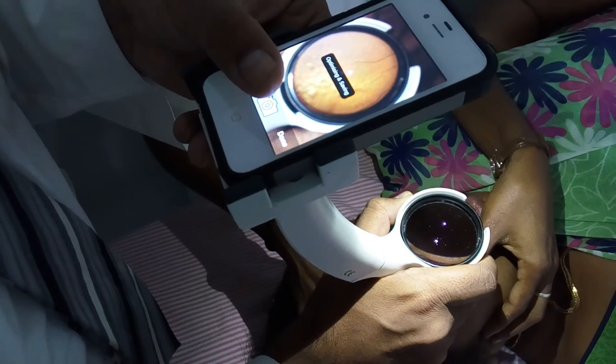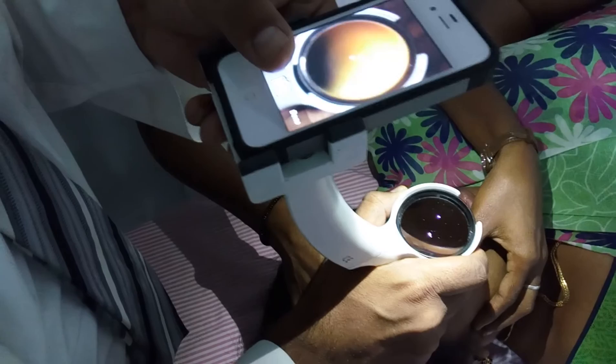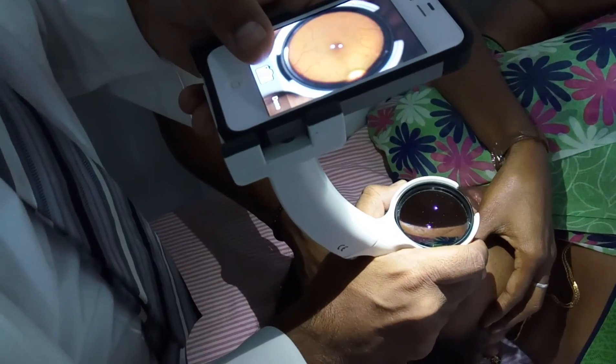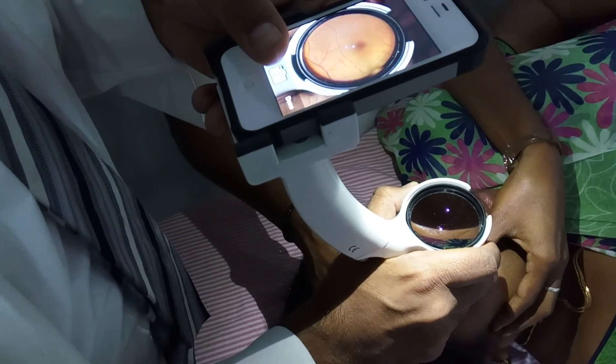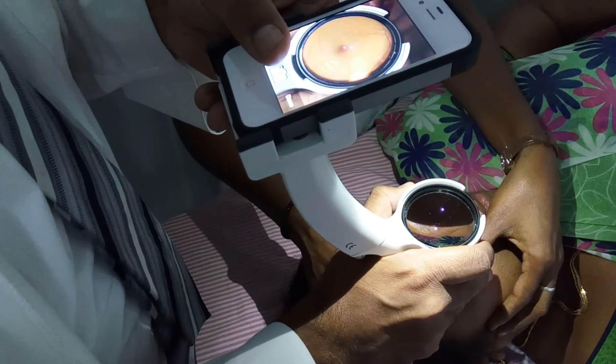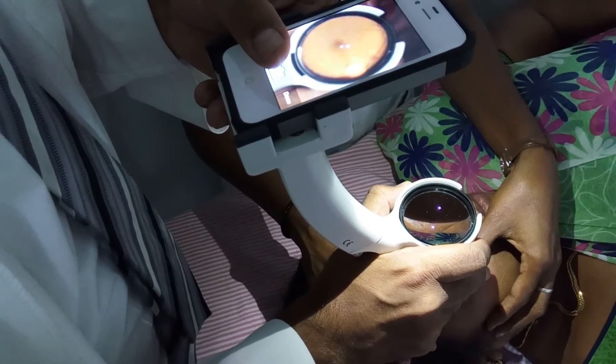You can ask the patient to look to the center again. The image is very, very stabilized — it is taking auto-focus — and now you can click a picture.